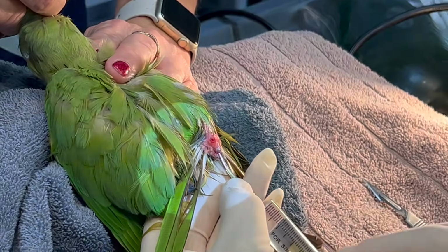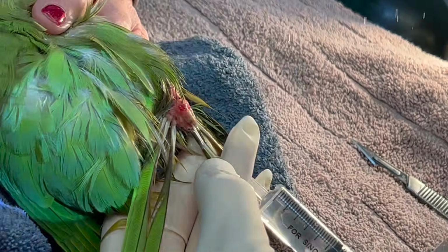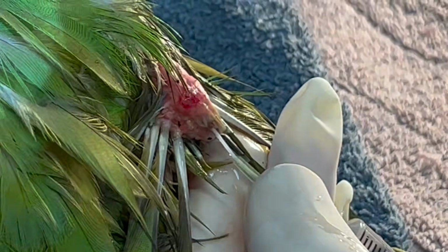Bird pus seems to be quite solid. Yes, bird pus is very solid. So now you can actually see we've got a catheter in the Preen gland, so we're actually flushing the Preen gland out. You see that? Flush, flush, flush, like a little fountain.